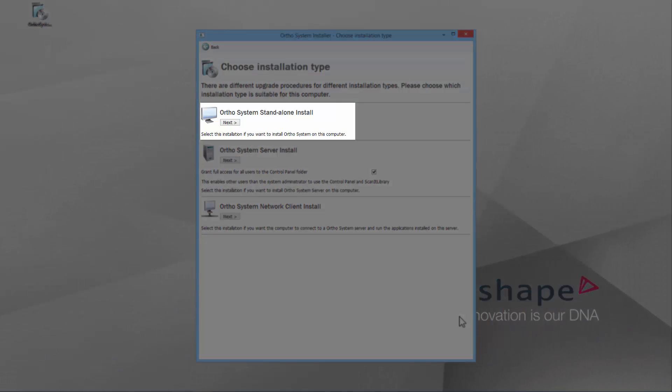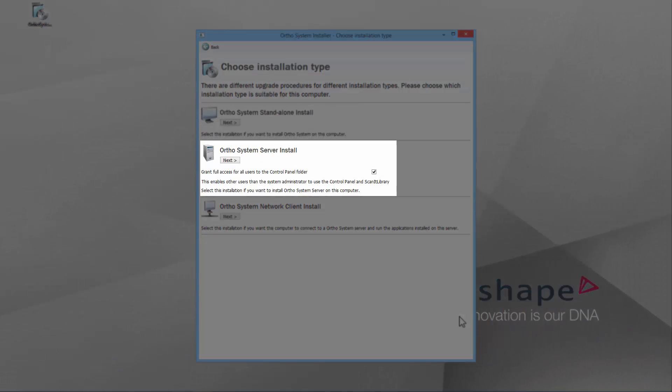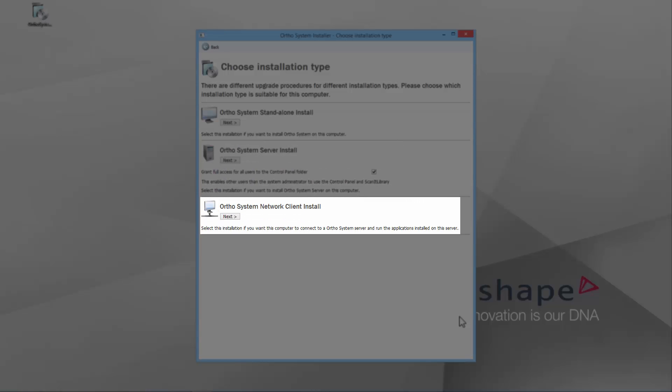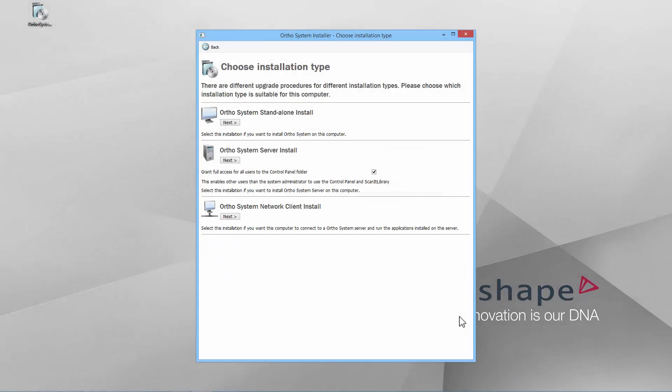Standalone, Server, and Client. For the purpose of this video, we will briefly describe the latter two.